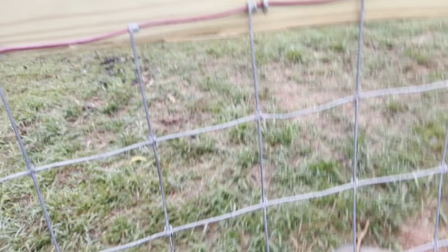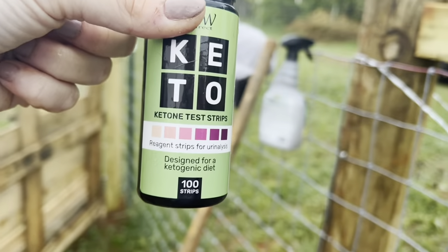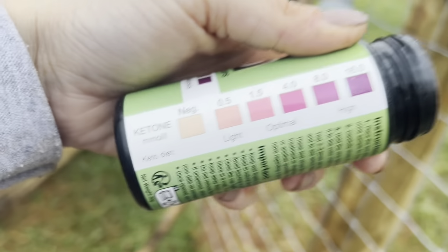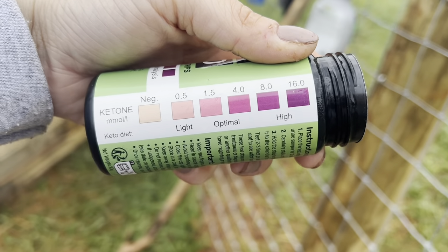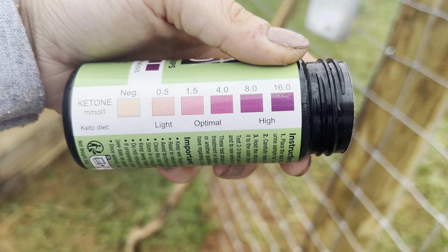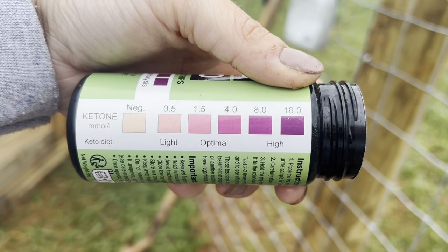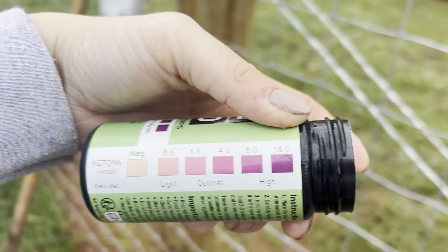These are just people ketone test strips. For our purposes, you really want to be negative completely — we're not really trying to get her into ketosis. You can see we've got negative, light, optimal, and then the high is really dark. If you wait more than 60 seconds it will always get dark, even with no pee on it, so you want to look at it within those first 60 seconds.